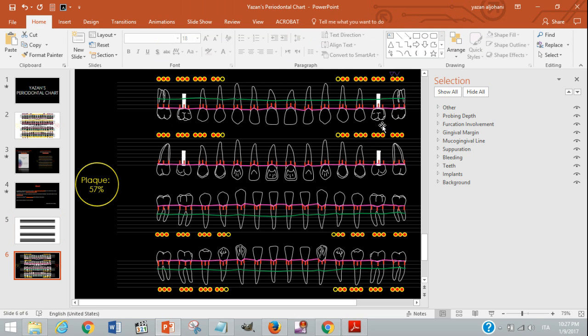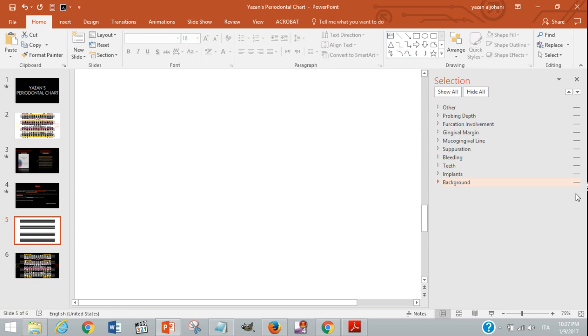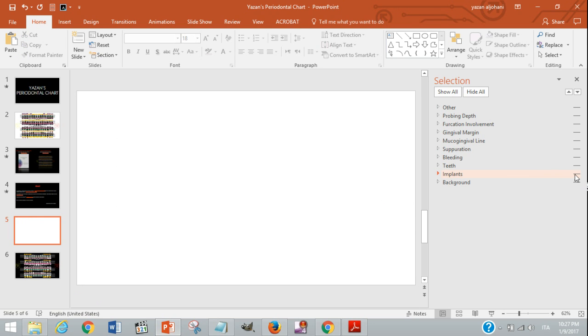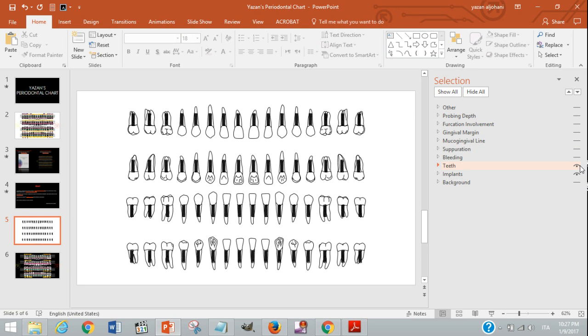We'll go here and simply remove the background so that we have total focus on the implants. Then we'll choose the implants. Now we can see the implants for all the teeth, so what we need is just to keep the implants for the upper sixes.